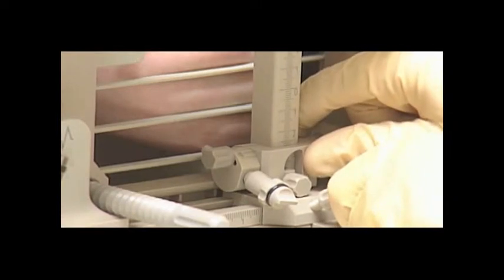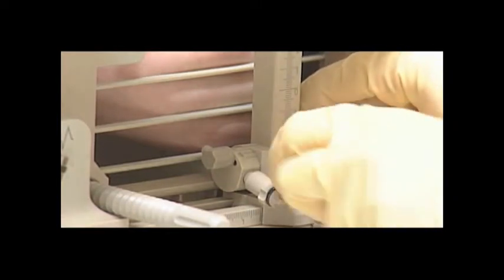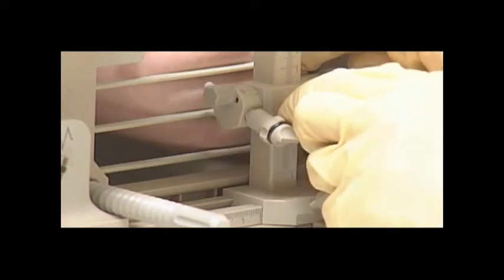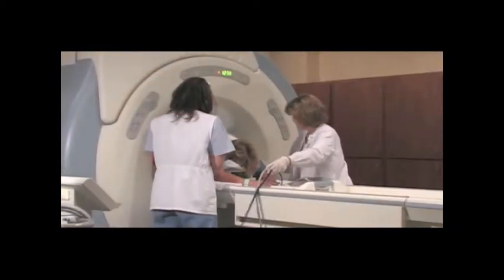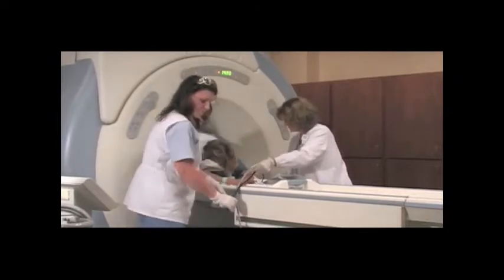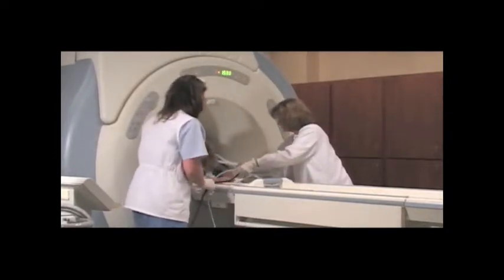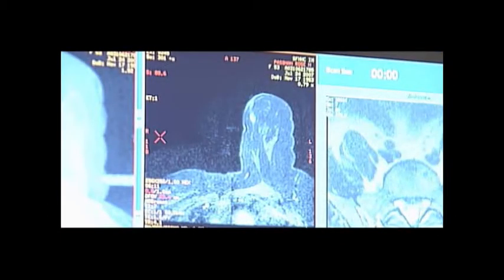Inside the imaging suite, position the pillar and post to the new X and Y values. This will be the point of entry into the breast. Move the patient back into the magnet. With the new pillar and post positioning, rescan the patient to ensure proper targeting. Scan the patient in the axial plane.